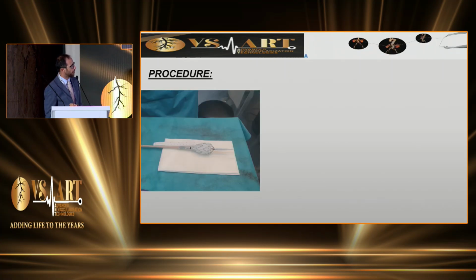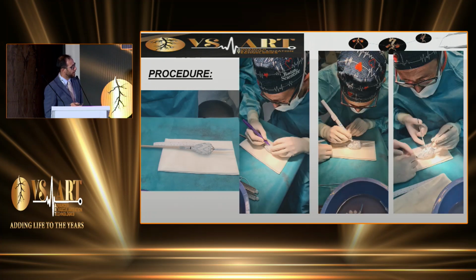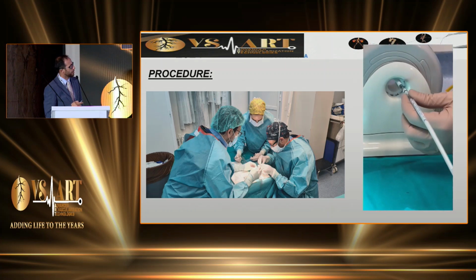And this is how we do this kind of procedures. Sometimes they are not usually elective procedures. In some cases elective because we don't have the technology available, but usually we just open a little bit the device, we make the marks, and we crimp the device with a crimper that they use for TAVI. So you have to be very careful.